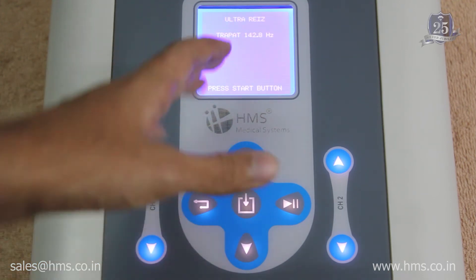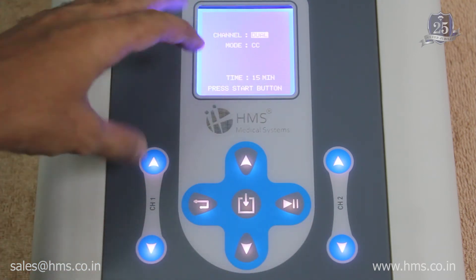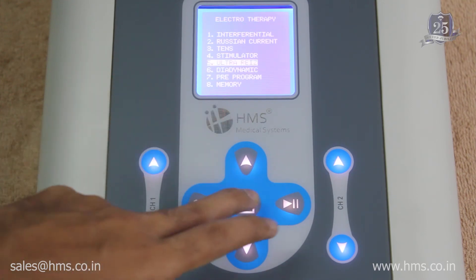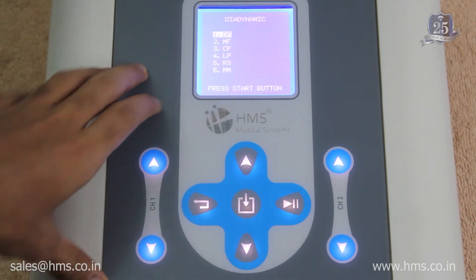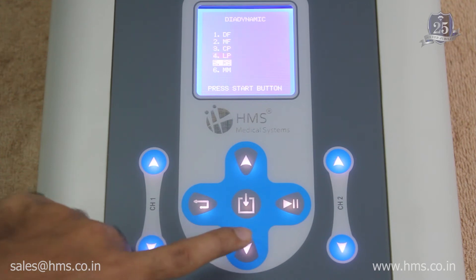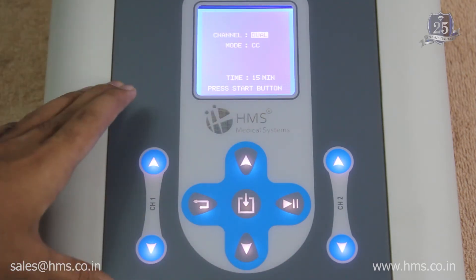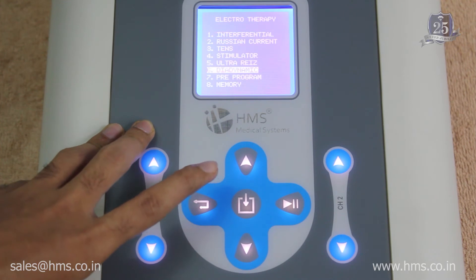With Ultra Reiz, the defaults are pre-set and you can start treatment by selecting whether to use both channels or a single channel, and choosing CC or CV mode. After Ultra Reiz, there is diadynamic, which has six modes: DF, MF, CP, LP, RS, and MM. Similarly, you can select single or dual channel and CC or CV mode.